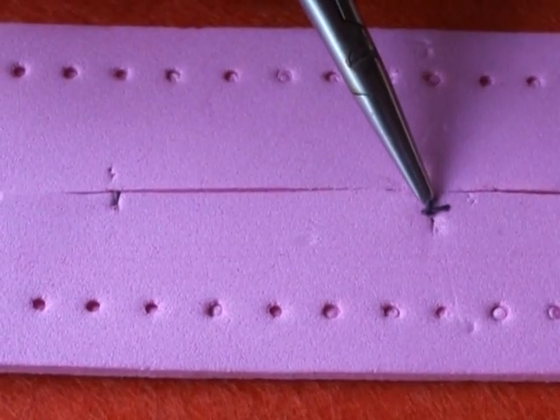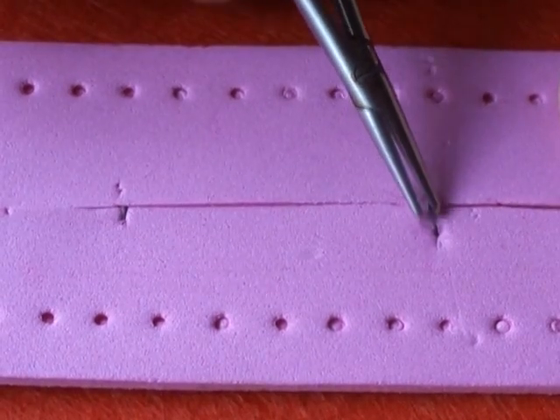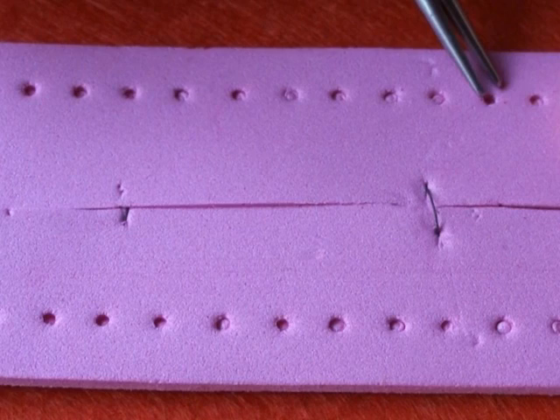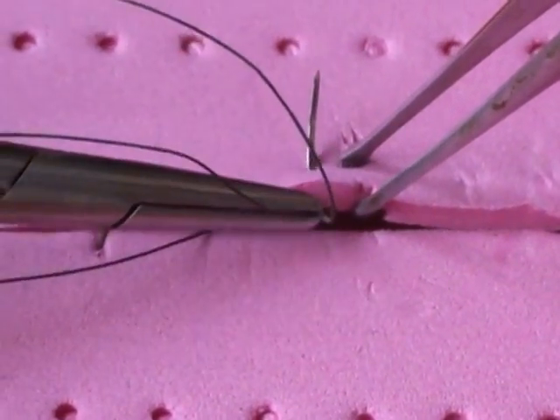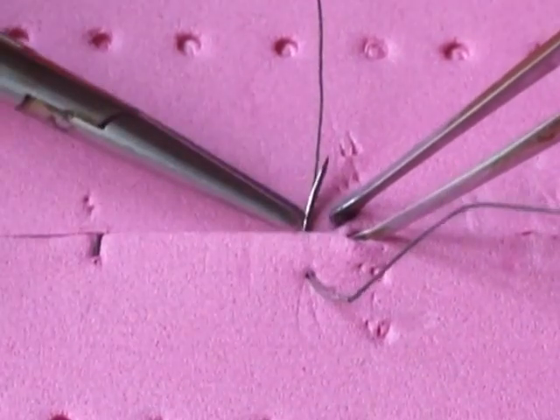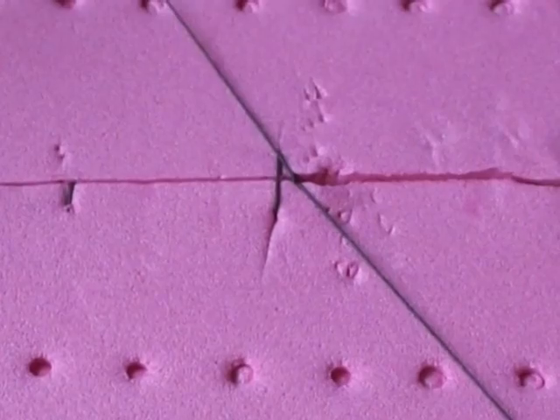There are two ways of burying the knot. First, the stitch can be rotated by grasping it with the suture-tying forceps, and pulling the stitch around so that the knot gets buried. Alternatively, if you begin and end your suture inside the wound, rather than on the surface of the cornea or sclera, the knot will automatically be buried.